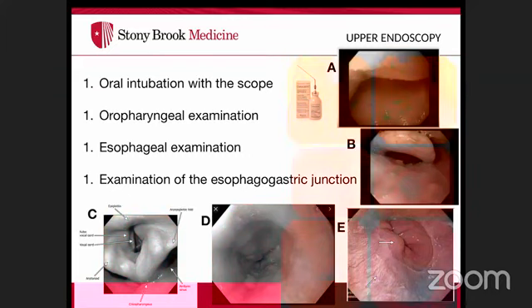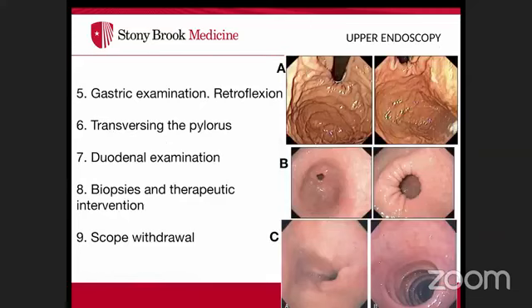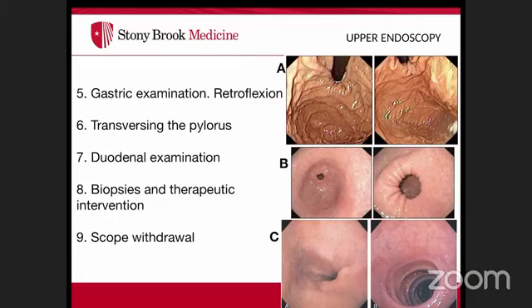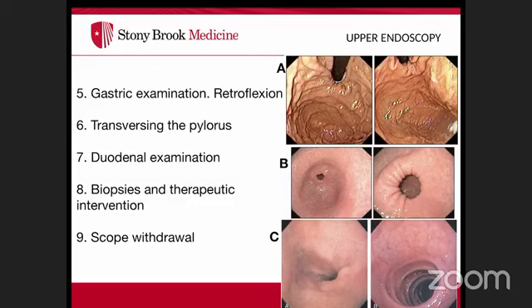Once in the stomach, slowly insufflate and suction any remaining fluid to prevent reflux. Examine all walls — the greater curvature, lesser curvature, and especially the angularis, where common pathology is often found. To retroflex, position the scope tip near the angularis, pull the large wheel toward you, and use your right hand to rotate and wiggle the scope.